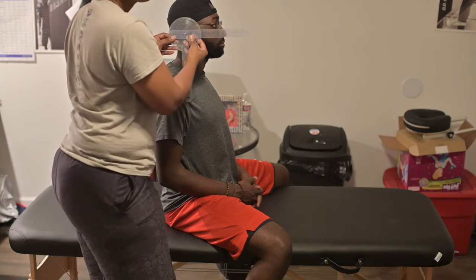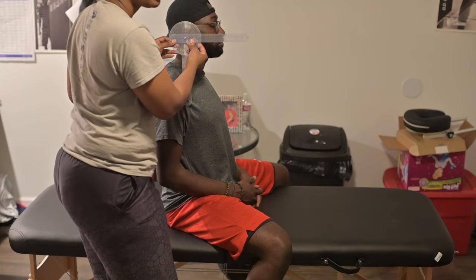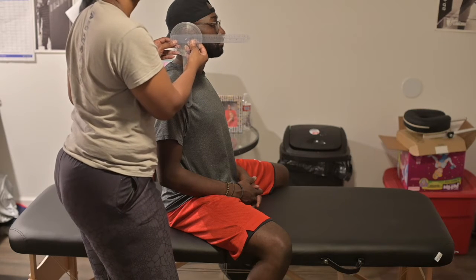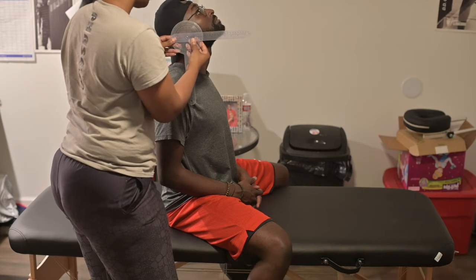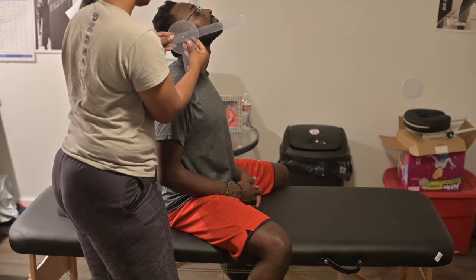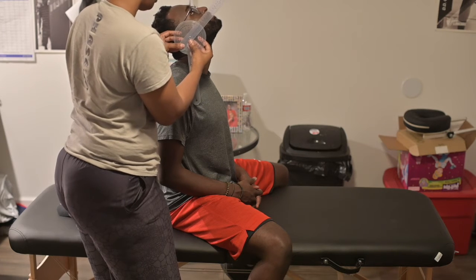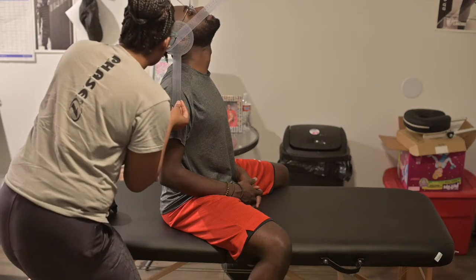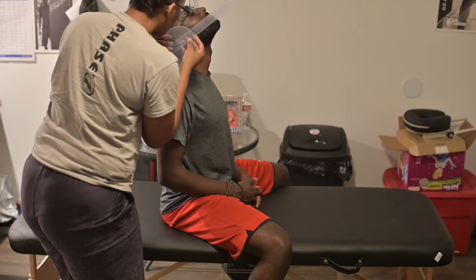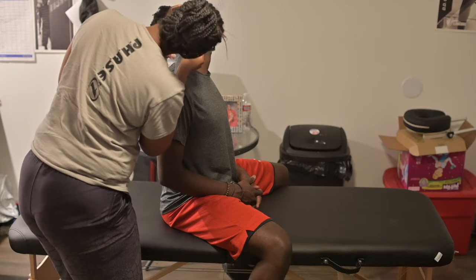So now he's going to perform cervical extension by tilting his head in a backwards motion as far as he can. Go ahead. Alright, so again, our mobile arm follows and stays aligned with the nares. So let me fix this. Alright, so acoustic meatus, and here aligned at the tip of the nose.